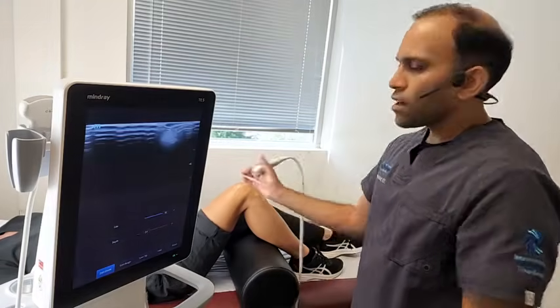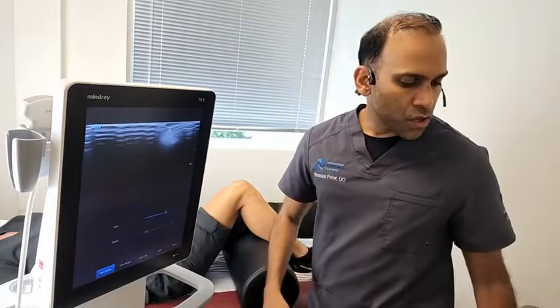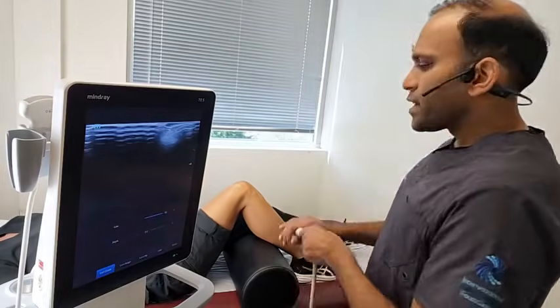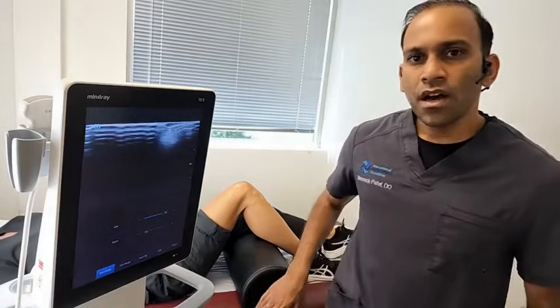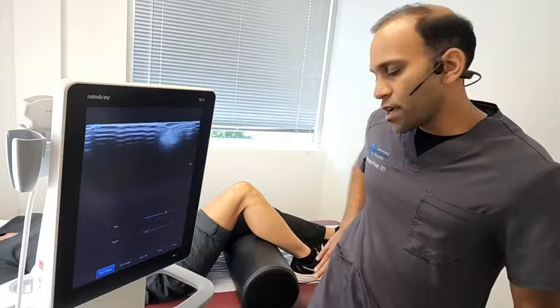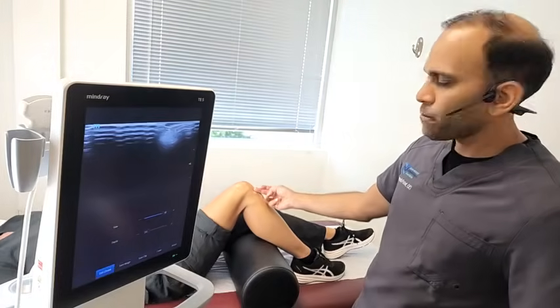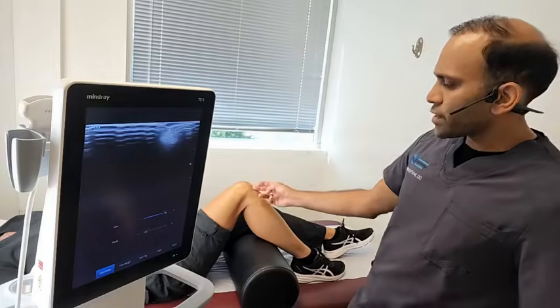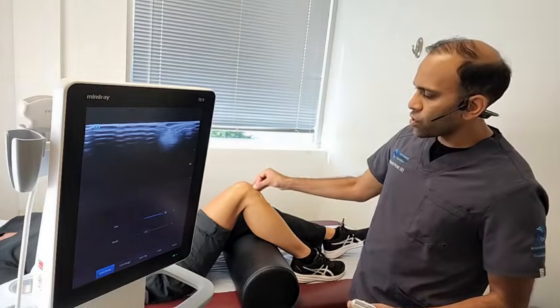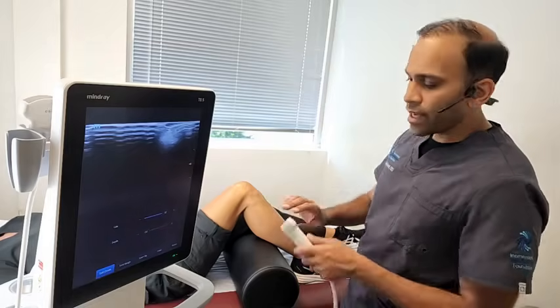So from here, I'm going to look at a structure that a lot of you may have heard about, which is called the iliotibial band. The iliotibial band is a band of tissue, of ligament, that basically comes from the outside of the buttock and goes down the side of the leg and attaches onto the knee. It actually has fibrous attachments, the most prominent of which goes to the lower leg, but has fibrous attachments that goes to the kneecap as well.